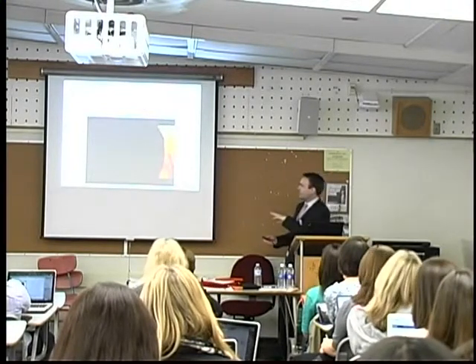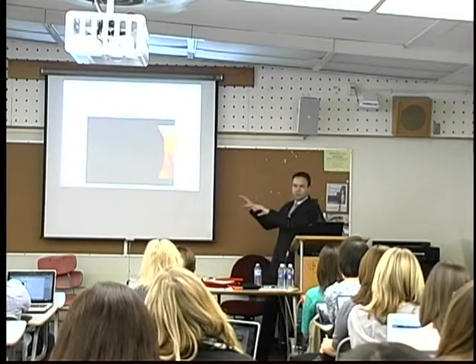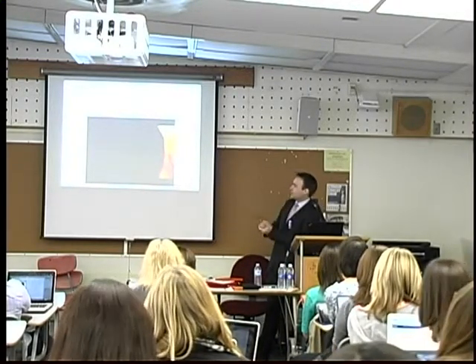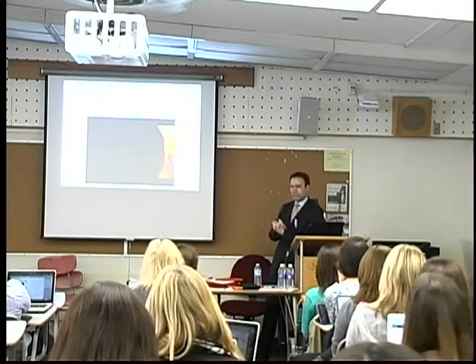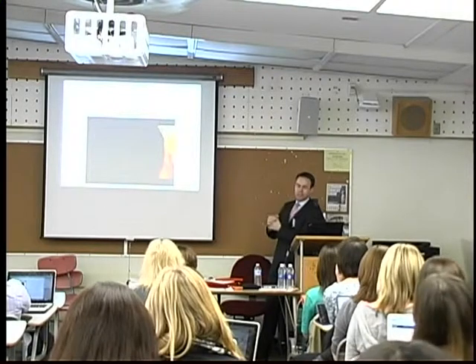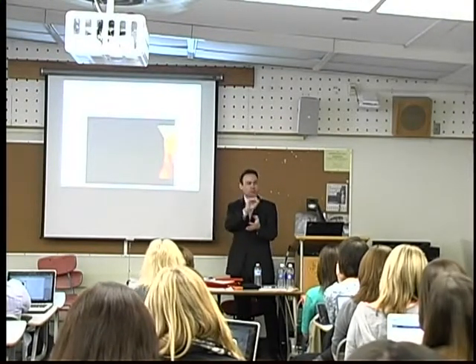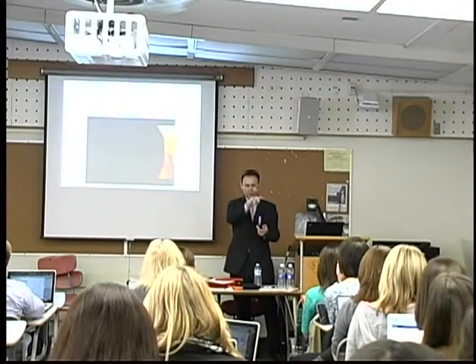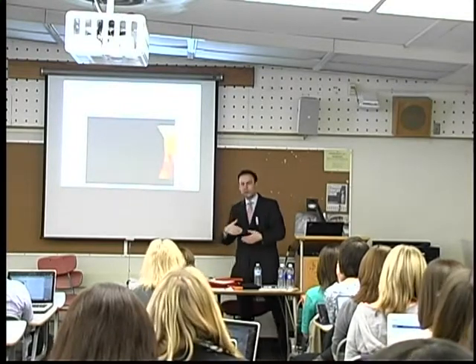We also learned that it is important to reshuffle, randomize the symbols. You could see that on the screen they were always scrambled up, so to say. That has the advantage that the kid always has to truly look at the symbols, and we're not teaching some automated motor sequence where they would always go from the first one on the left to the second one on the right, and then one row down and so forth.